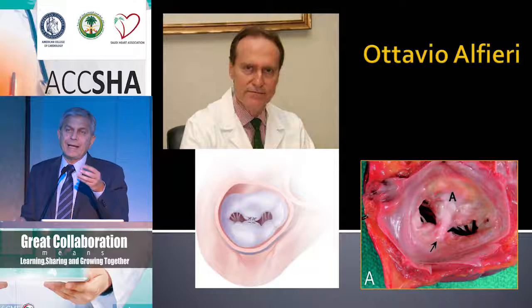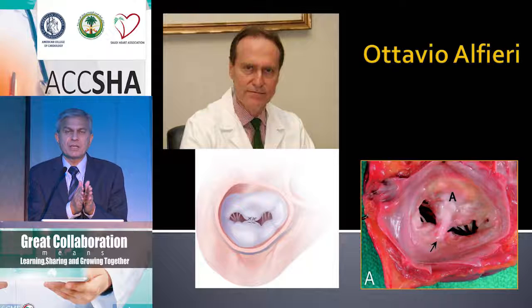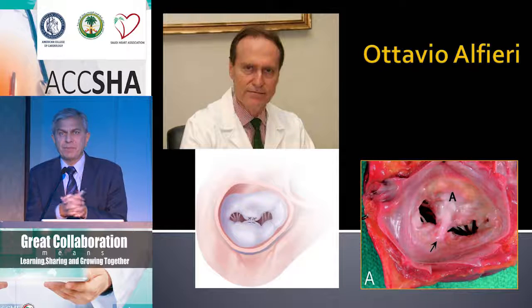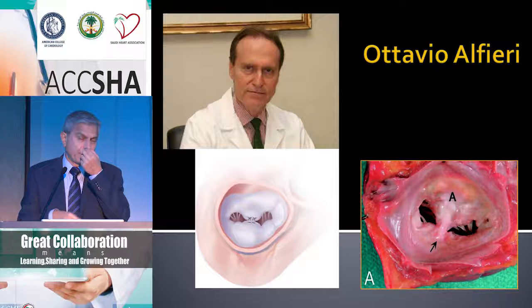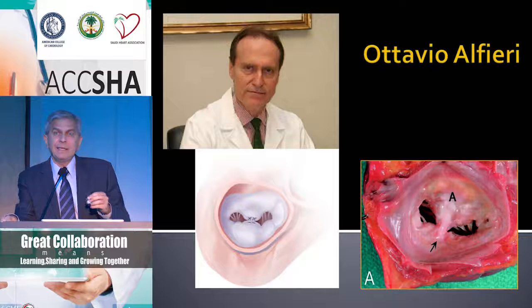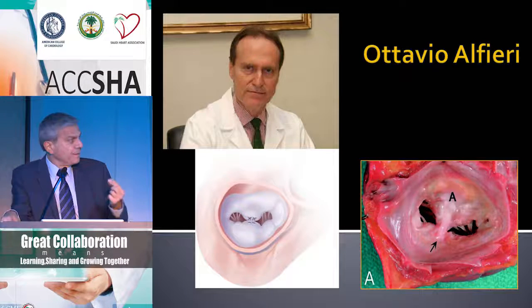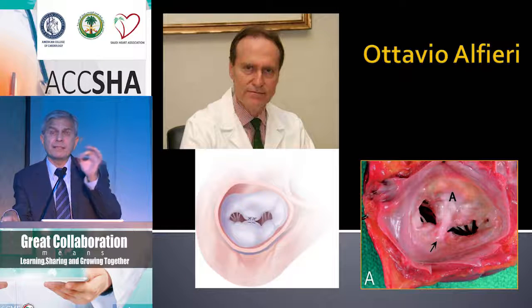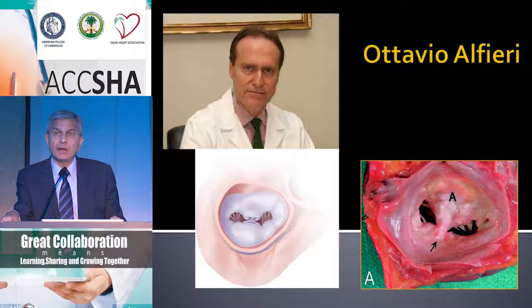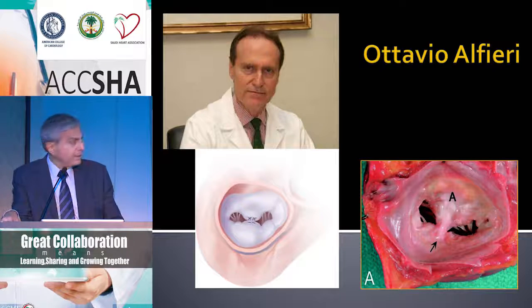Since for the surgeon, the ideal situation is to fix a posterior leaflet prolapse, there are non-ideal situations, such as when there is an anterior leaflet prolapse or bileaflet prolapse or other types of prolapses. And for that, he envisioned and designed the concept of suturing the leaflets together and creating this bilobed orifice, reducing the mitral regurgitation. And this is where the clip idea came from.